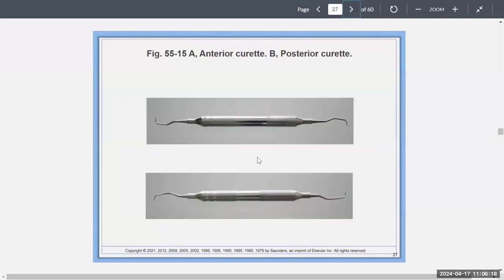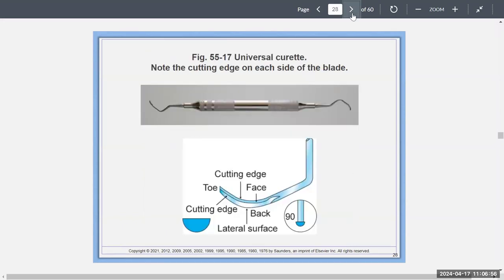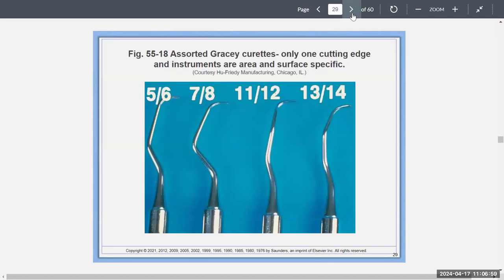One curette is for anterior and one is for posterior. A posterior curette has more kinks to it so you can reach the back of the mouth for molars and posterior teeth. The anterior curette is not as angulated because you're just dealing with anterior teeth. Universal curettes come in standard designs, and Gracie curettes come in numbers: 5-6, 7-8, 11-12, and 13-14 — that's how specific it gets.